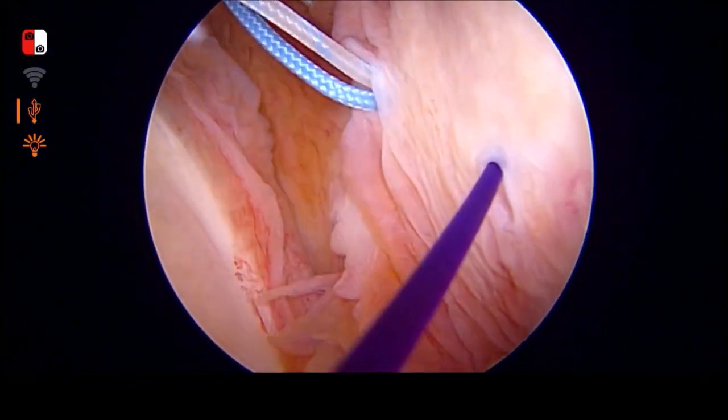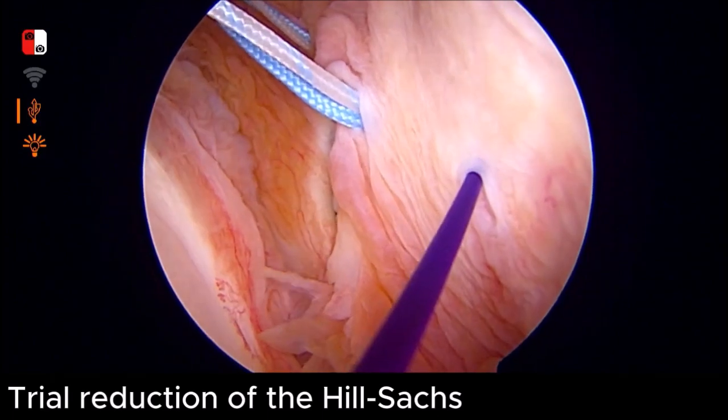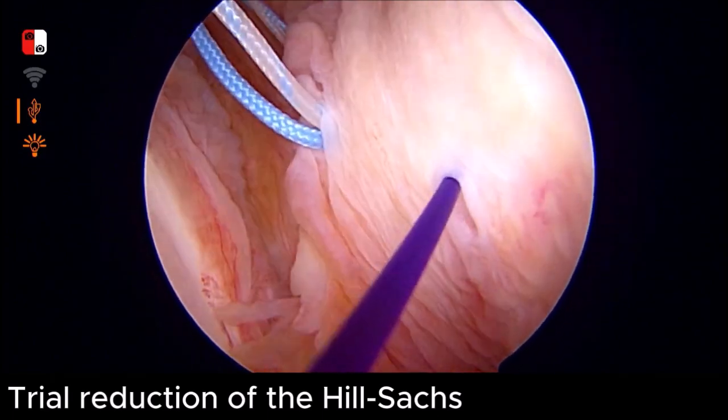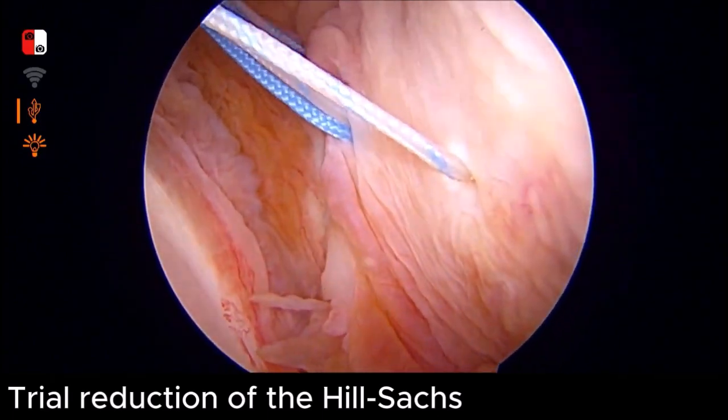After the sutures have been passed, trial reduction is done by simple tensioning of the sutures.